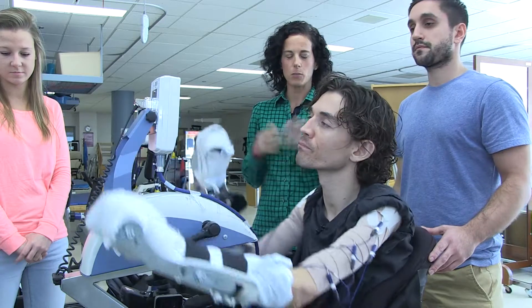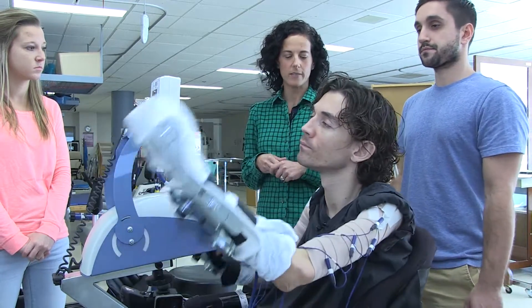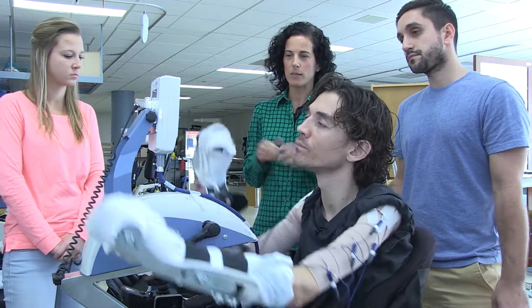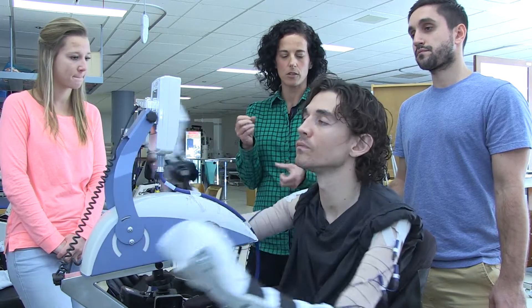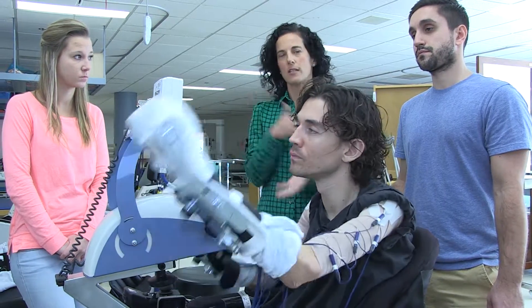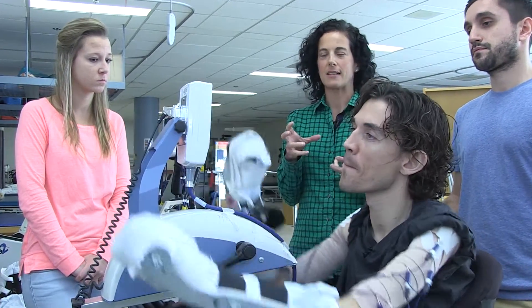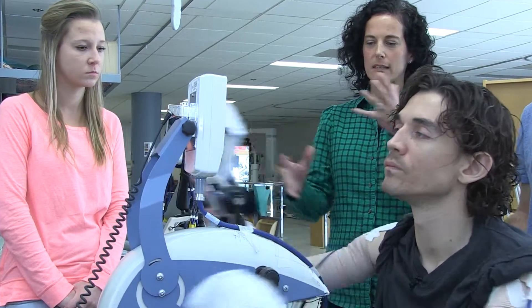It works with people who've had cervical level spinal cord injuries where, as a result, they have some weakness or paralysis of their arms. This machine uses electrodes that produce electrical stimulation externally to these muscles, cueing them to contract. The functional piece is this coordinated cycling motion.